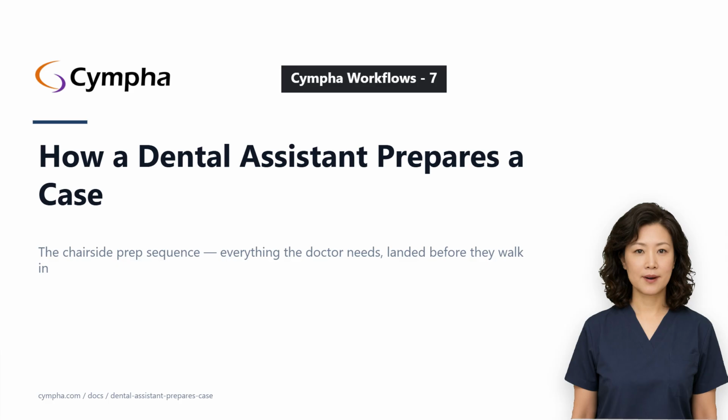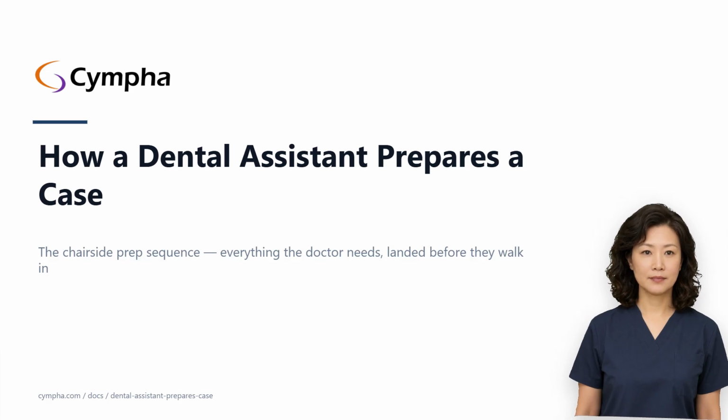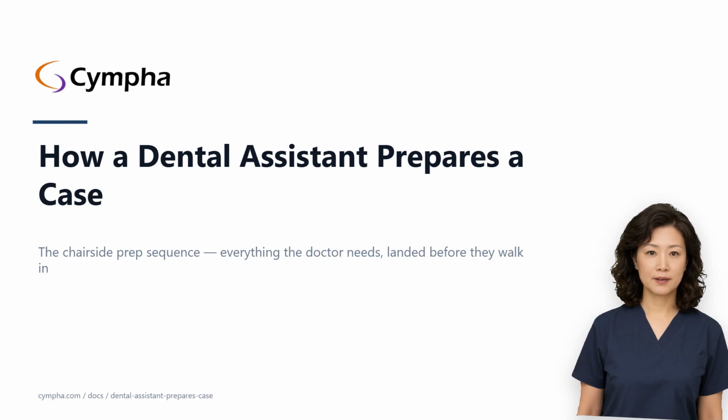If you're the DA in a practice that runs on Cympha, your job before a routine new visit is simple to state. Land everything the doctor needs before the doctor walks in: the case, the photos, the scans, and the notes. This lecture is that sequence, in the order you'd actually run it.